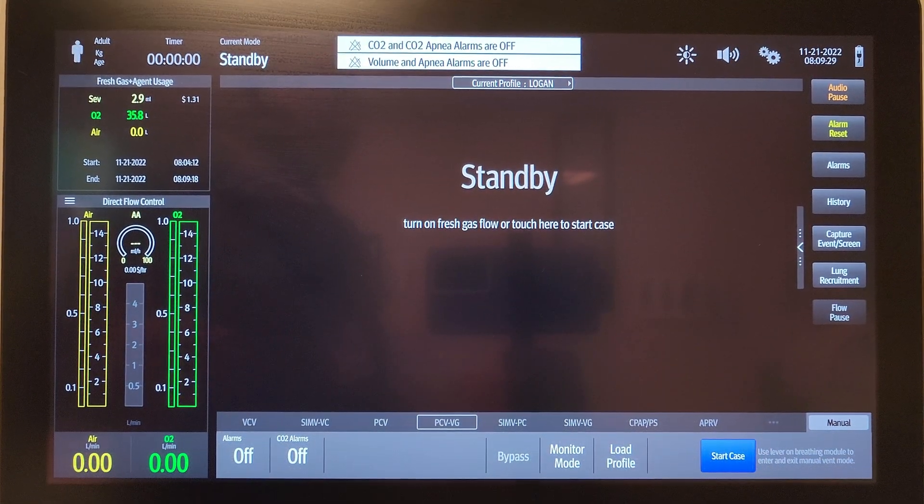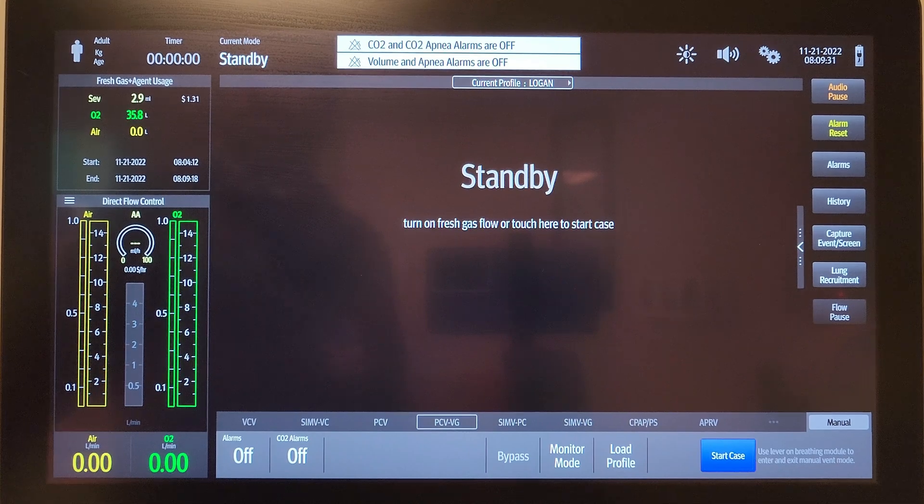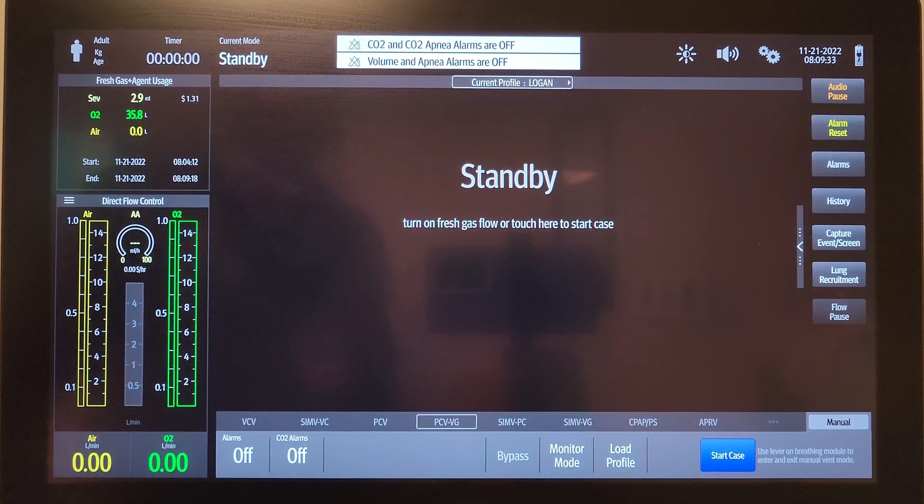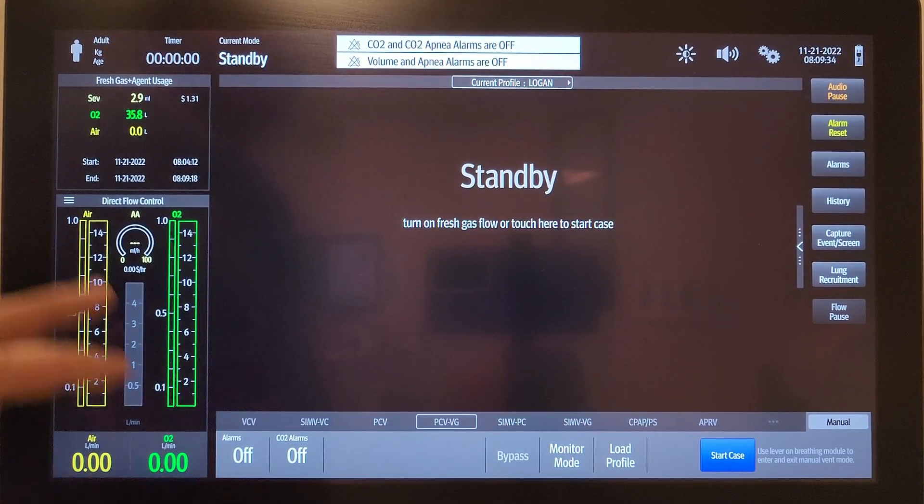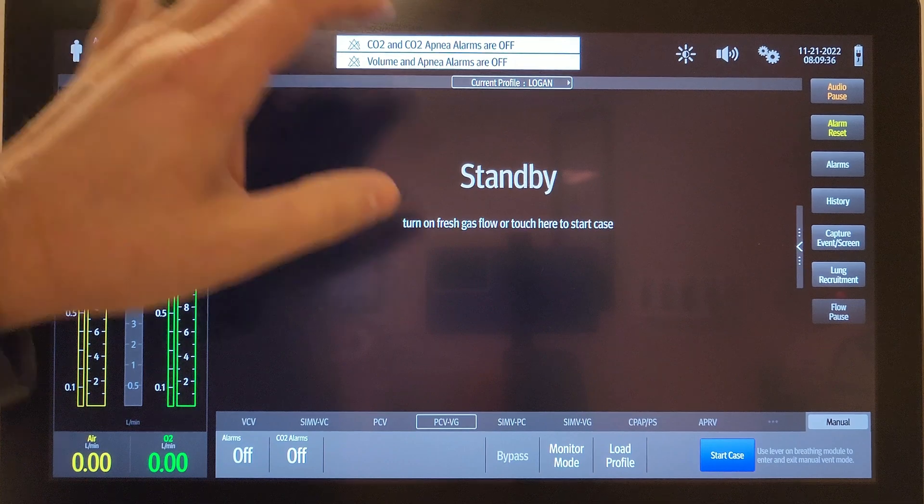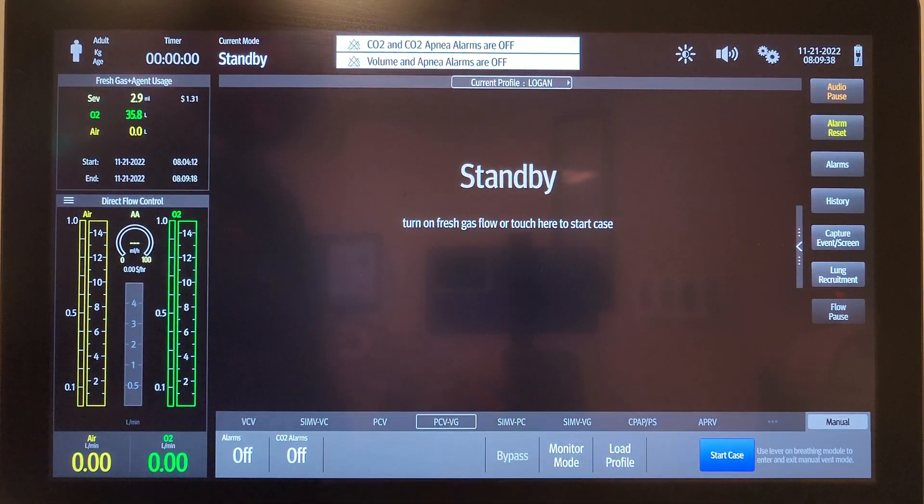Okay, let's say you show up in the middle of the night and you want to do a quick machine check on this thing. Here's the screen without turning on any fresh gas or clicking start case or anything.